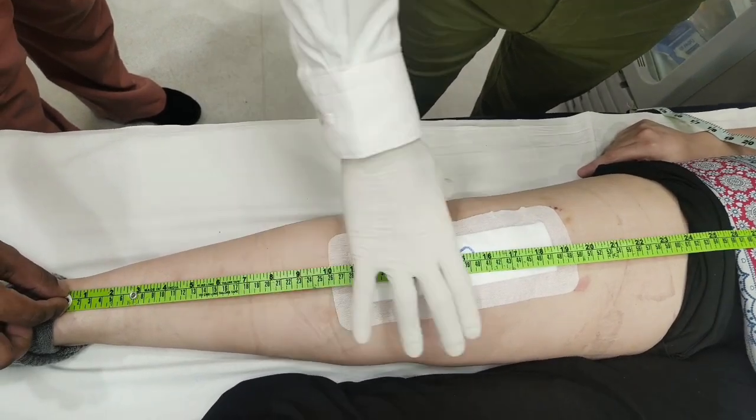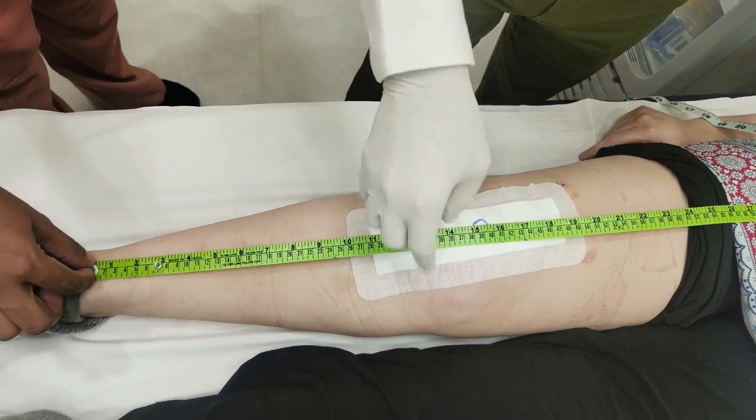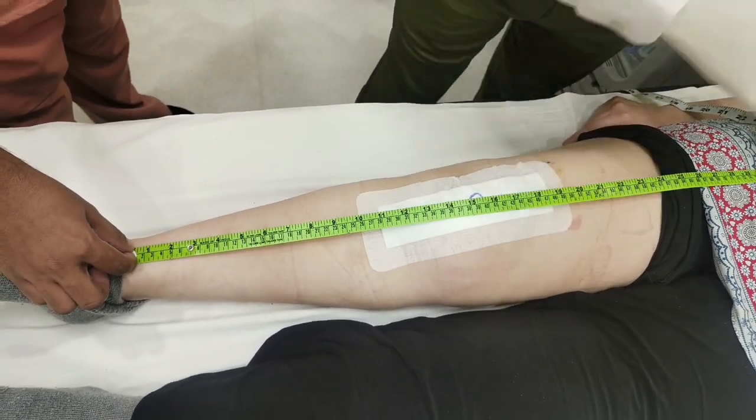The weight will now be transferred correctly right through the tibia. Previously the deformity was like this — the angle was increasing and it was very painful. Knee replacement is a very successful procedure. This operation has been done for many years and millions of people are taking advantage of it. Sometimes there are complications, like we have seen in this case. The implant had failed, the patient was in pain, and the patient came for revision knee replacement.